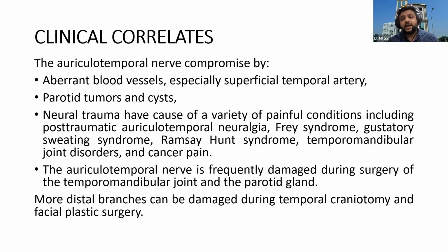These problems may have been diagnosed by other physicians, for example Ramsay Hunt symptoms by the medicine department. But if there is a persistent sensory problem and some paresthesia, you can do a diagnostic block to see whether it is the cause of the symptom or not. After that, you can do radiofrequency for this area also.